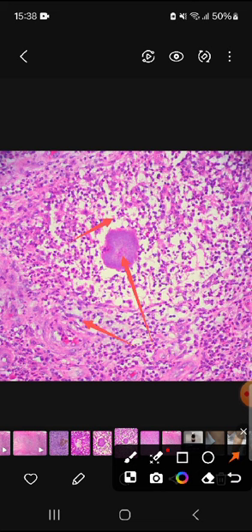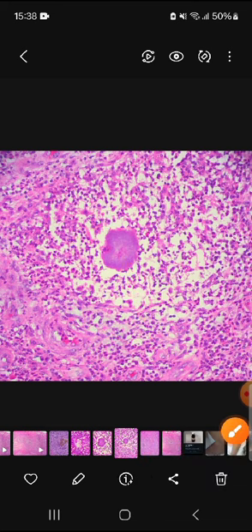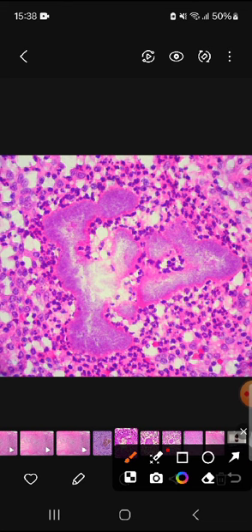The infiltrate also consists of histiocytes, and later on there can also be granulation and fibrosis, lymphocytes, and eosinophils. In another area we can appreciate a peripheral pinkish rim, which is the in vivo formation of intensely eosinophilic material that can be star-like, asteroid, or club-shaped.